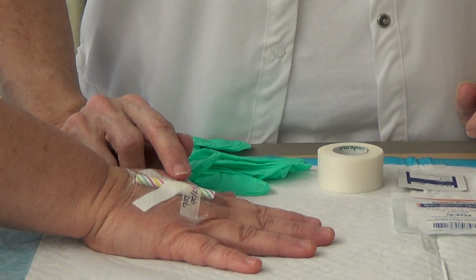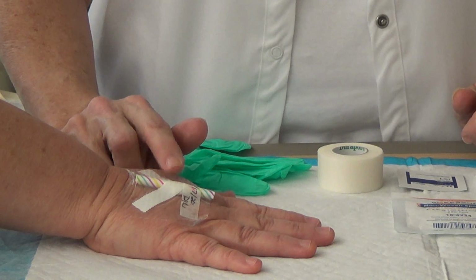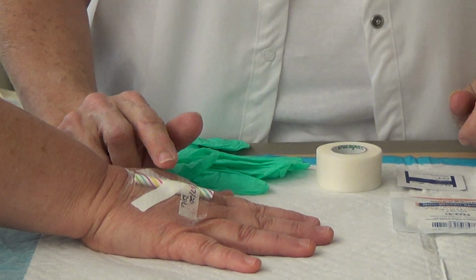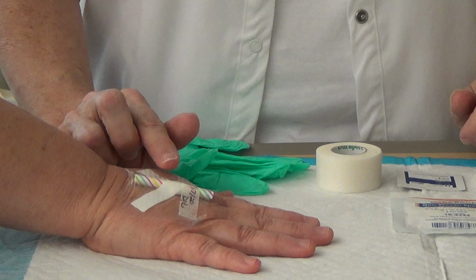Notice also that we have the size of the needle, the date, and the initials of the person that inserted this angiocath. That's very important because according to the Intravenous Nurses Society, they need to be changed every 3 days, or according to hospital policy. So this patient's going to go home. We're going to go ahead and take this out.